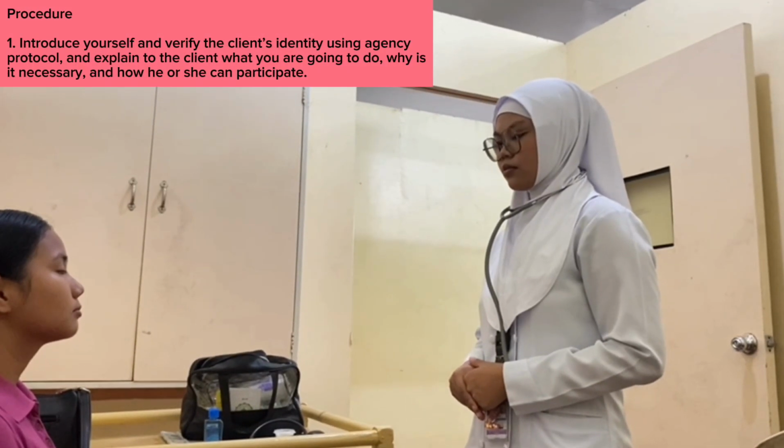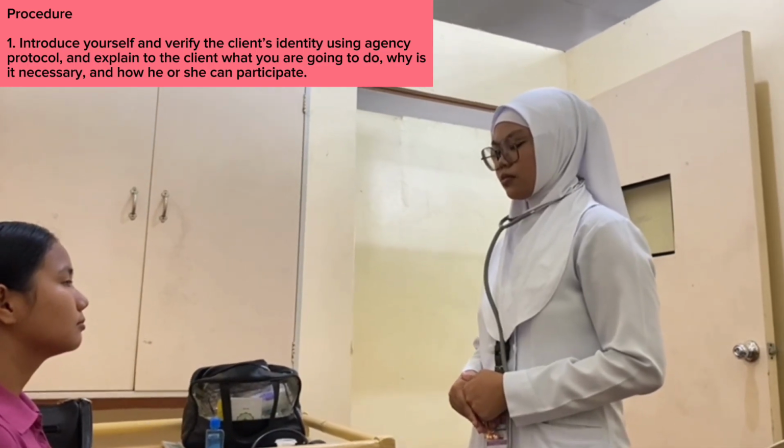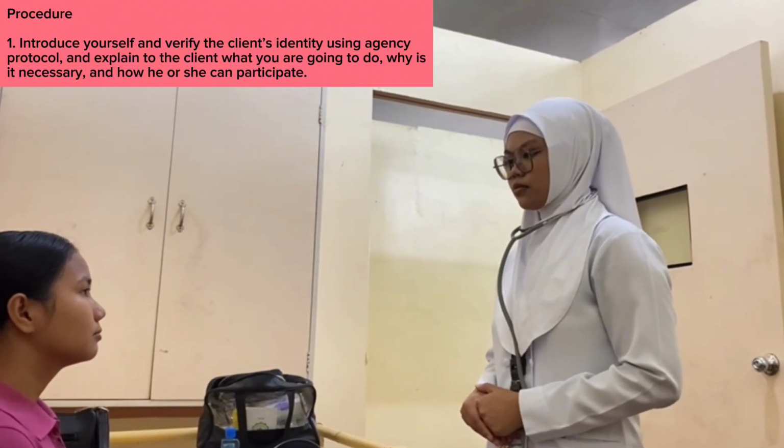First, introduce self and verify client's identity using agency protocol. Explain to the client what we are going to do, why it is necessary, and how she can participate.